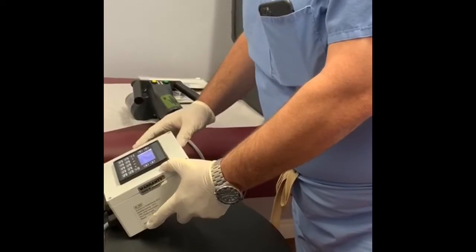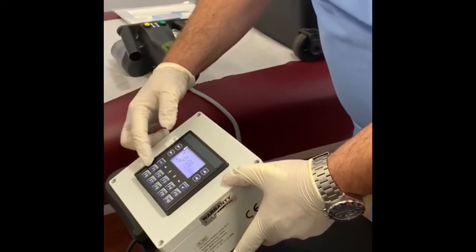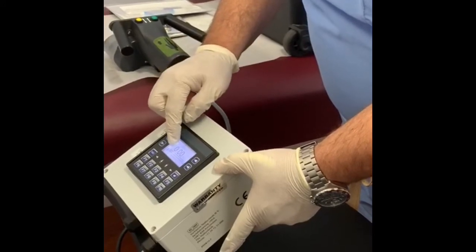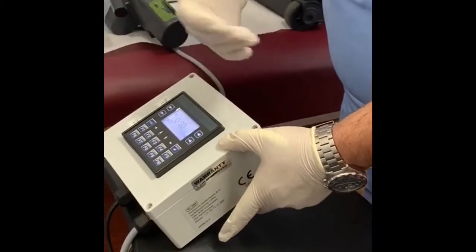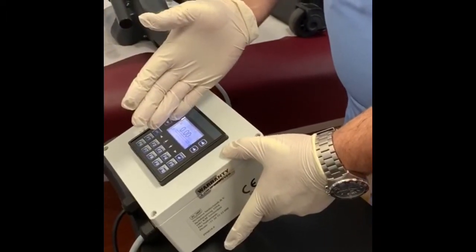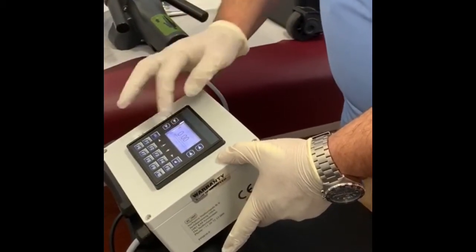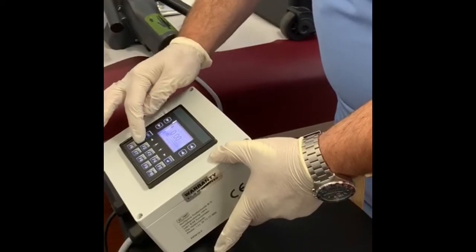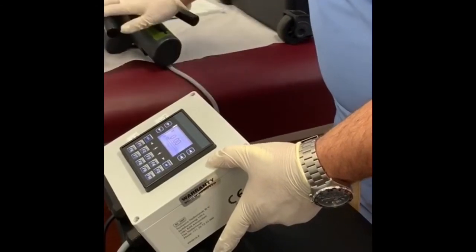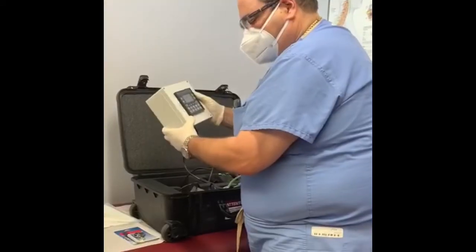There are a lot of buttons here, but the only buttons you need to worry about are the top arrow and F1. The top arrow, labeled step one, zeros out or resets the device. So when you do one side and it stops at 0.33 millimeters, to go to the opposite side you would first press this arrow to go back to zero. Then F1, labeled step two, is actually the on/off button for the device.